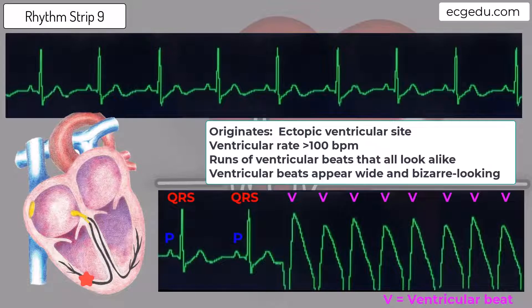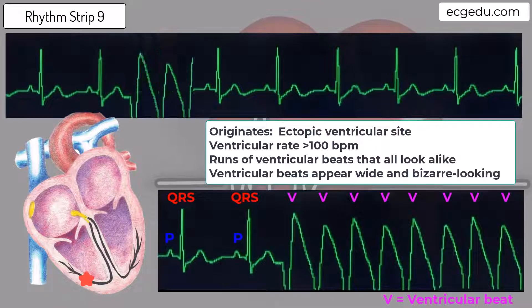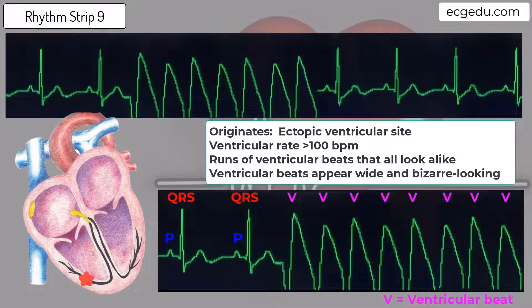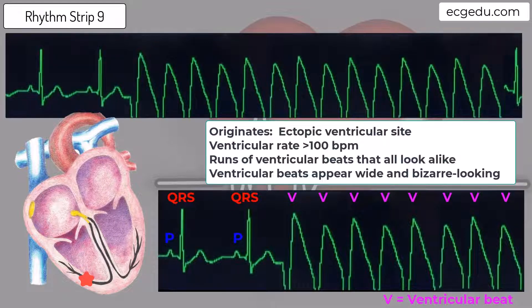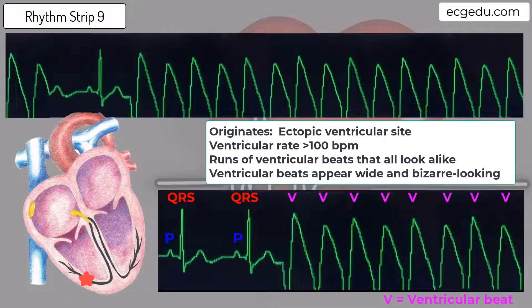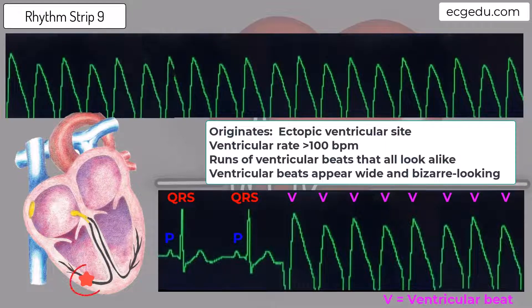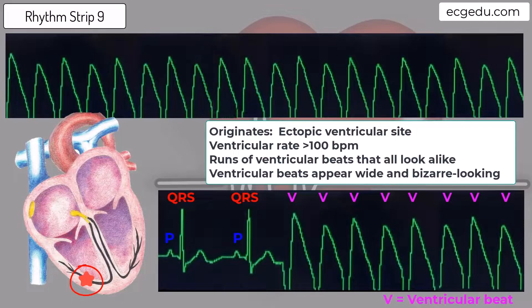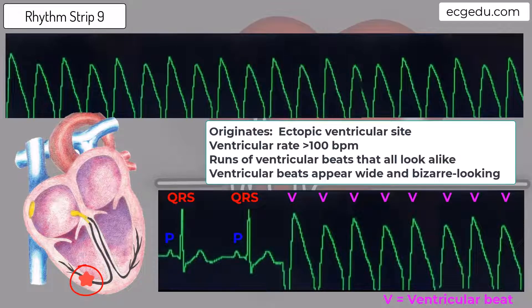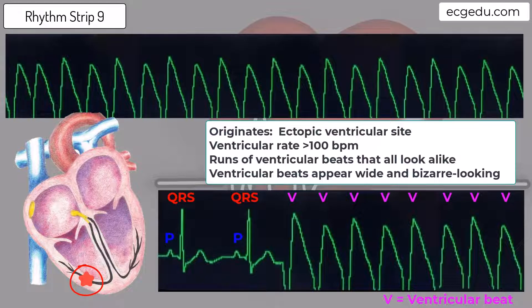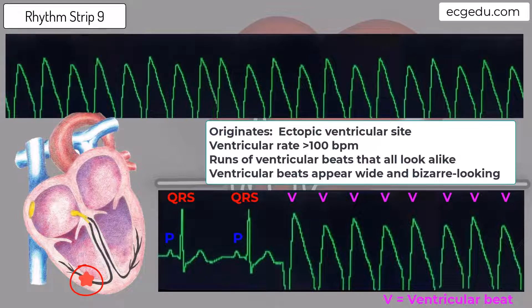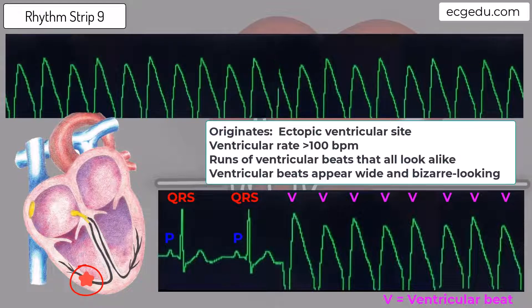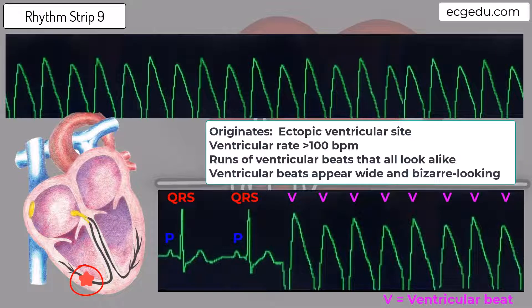This rhythm begins as normal sinus rhythm and then becomes monomorphic ventricular tachycardia. Monomorphic ventricular tachycardia is a rhythm that originates from one ectopic site in the ventricle and beats at a rate greater than 100 beats per minute. All of the wide, bizarre looking ventricular complexes look alike and have one form or shape.